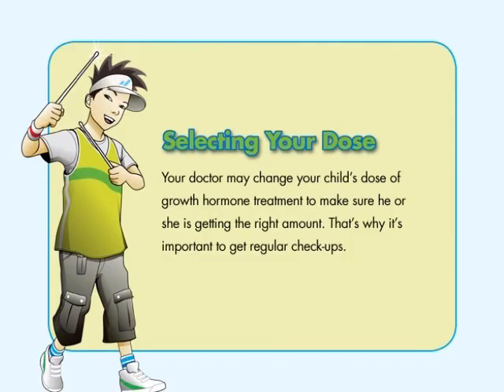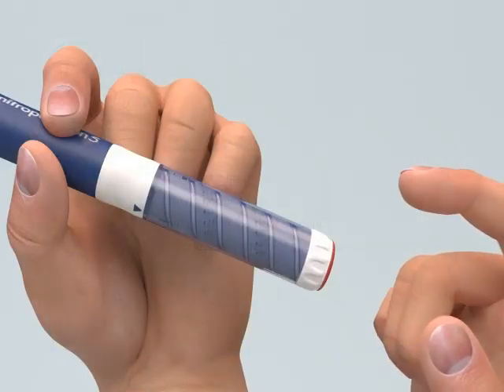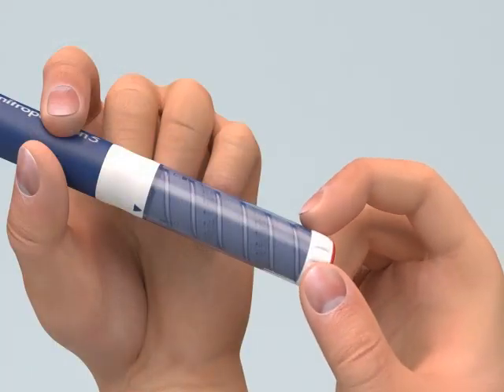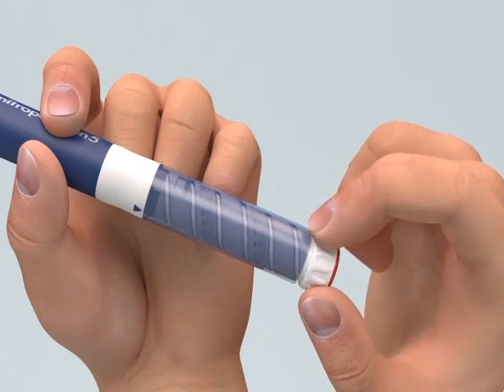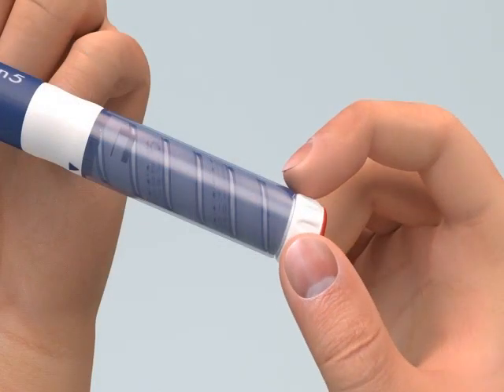To set your dose, turn the dose knob until you see the number of milligrams for your dose in the middle of the dose window lined up with the arrow. You will hear a click for each dose increment you dial, but you shouldn't rely on the clicks to measure the correct dose.